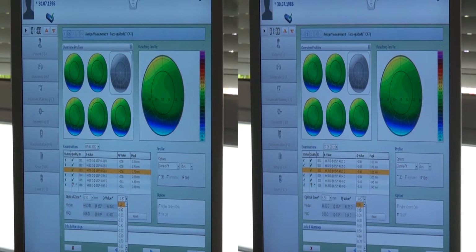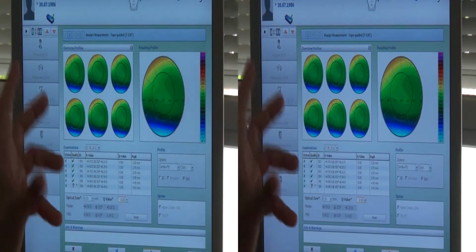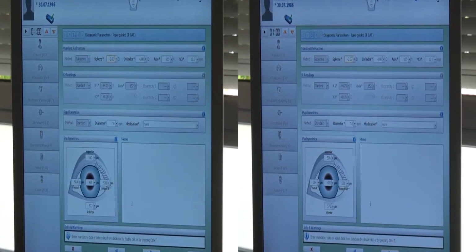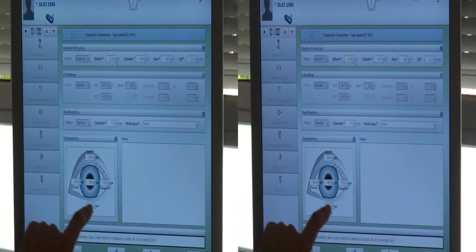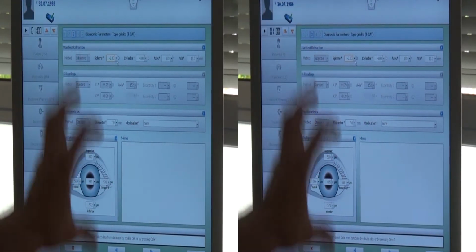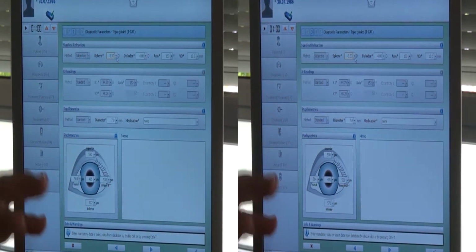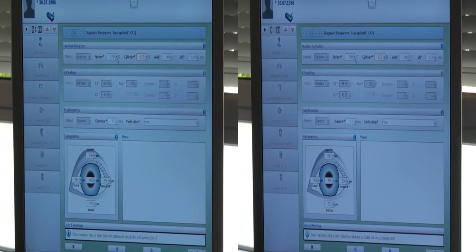And we'll proceed with adjusting Q value to 0 because all keratoconic eyes have very high Q values, so we don't have to enhance Q value. This saves a little bit of tissue. This is the purpose of that. We'll go on to the next step where all of the data, and I'd like you to pay attention to this, all the pachymetry data on the cornea have been already placed onto the treatment plan based on the pentacam pachymetry maps. So this is done seamlessly, automatically.